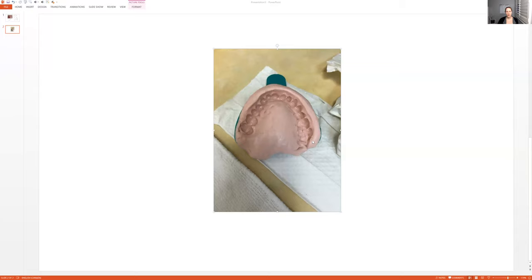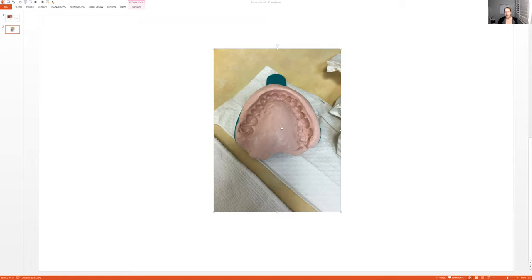So you see this fold up here. You need to have that there. All of the teeth need to look like they're in there. So no tears, no rips. Those are kind of the main things.